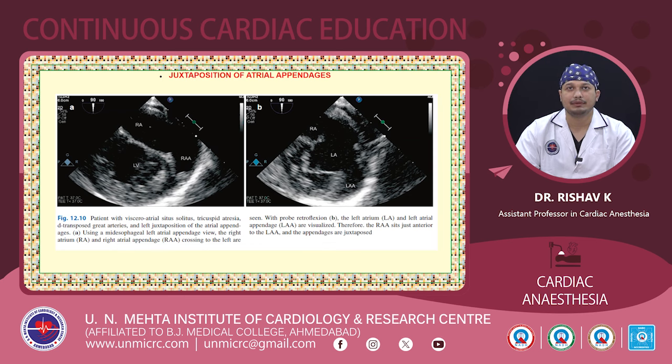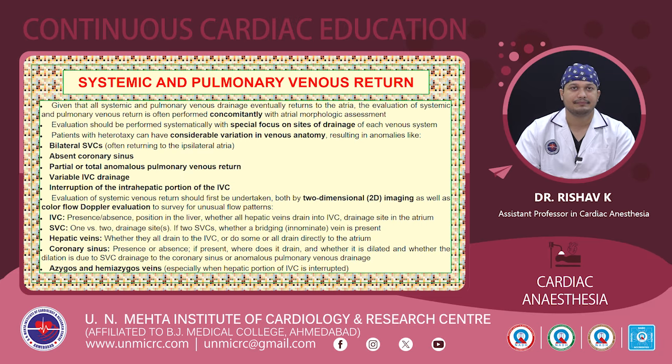Now coming to one of the rarer anomalies that we see, that is juxtaposition of atrial appendages. Here we can see that both the right atrial appendage and the left atrial appendage are located on the same side. A little bit of probe retroflexion has been done on the image to the right. The image to the left shows the presence of the RA and the RAA, while the image to the right shows the presence of the LA and the LAA.